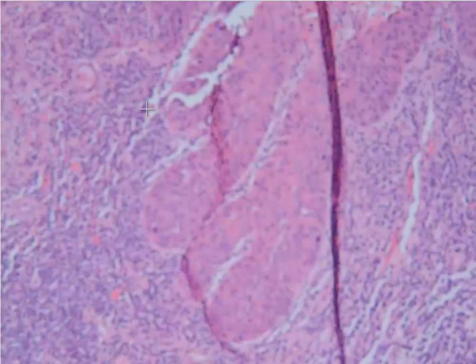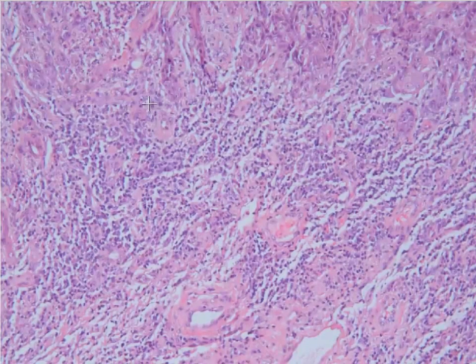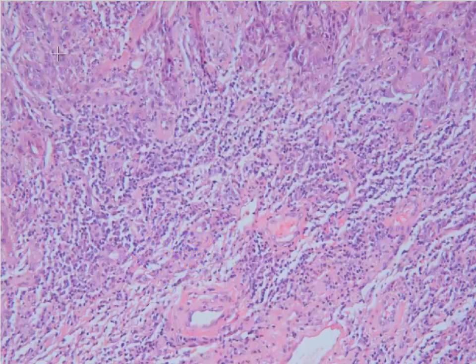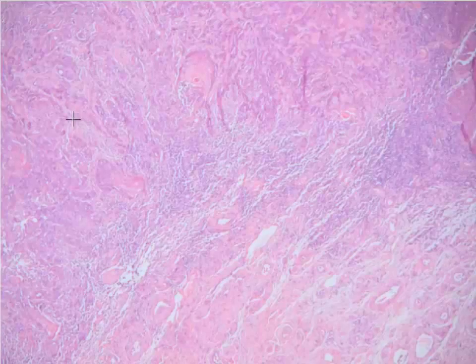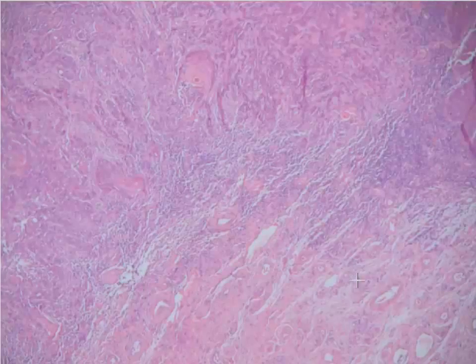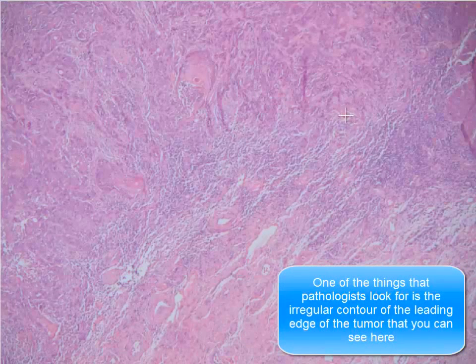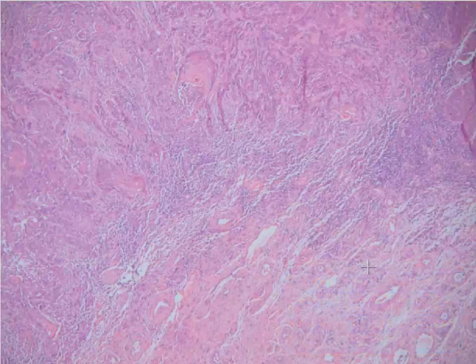As we move closer to the tumor, one of the defining characteristics of a squamous cell carcinoma is that it breaks through the basement membrane and the cells become invasive into the dermis. In this case it's actually pretty hard to see, but there are small little nests of malignant cells breaking off of the epidermis above and invading into the dermis below. This is easier to see at low power — you can see little tongues of squamous epithelium that push down into the dermis, with abnormal keratinization including keratin pearls, which are seen in invasive processes.